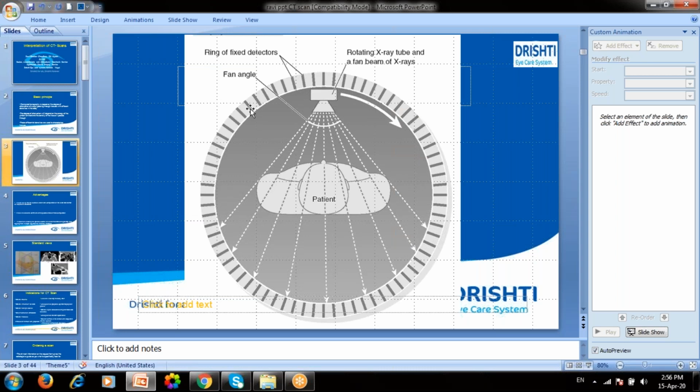In your computer, while doing a CT scan orbit, nowadays it is an automated machine, so you will automatically get the size. If you specify what you want measured, you can get the size automatically. In ancient times, you needed to mark the margin manually by hand, and after that the size could be measured. Nowadays nothing has to be done: just do the CT scan, and whichever area length you want can be given by your CT scan machine itself.